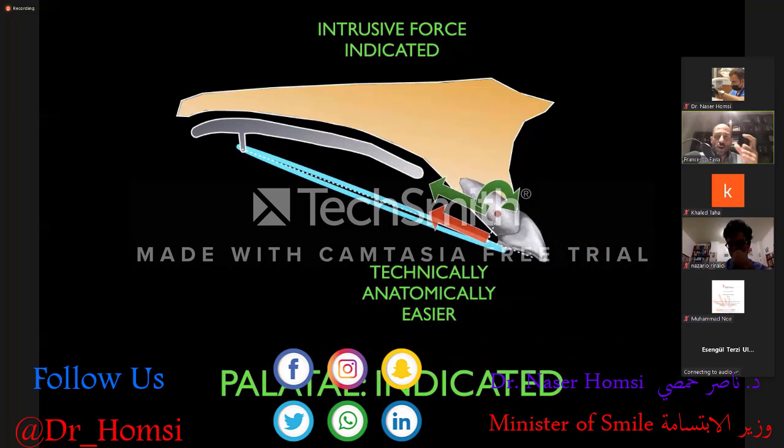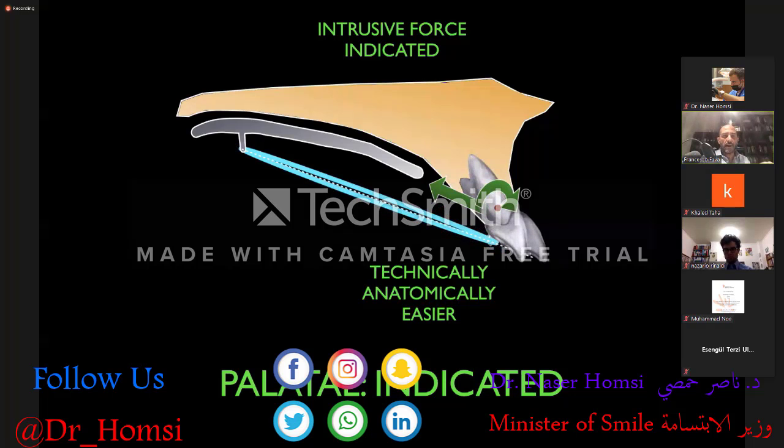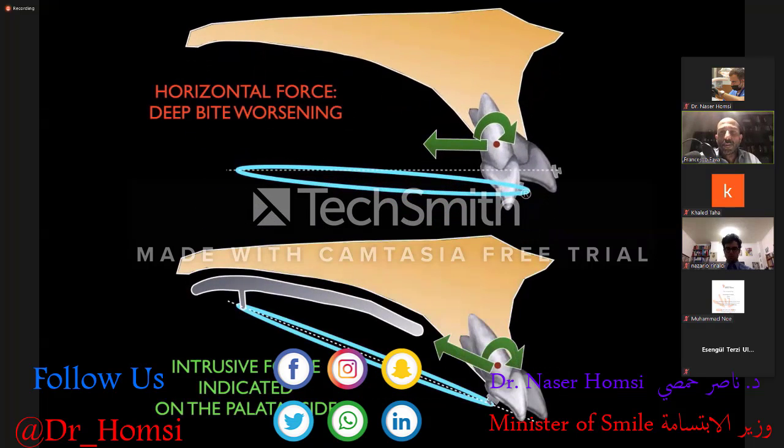We could try to change the point of application of the force, passing to the palatal side of the incisor, and that would be much more indicated from a biomechanical point of view, because it would tend to intrude and to retrocline the upper central incisor. It is quite easy to obtain anchorage in the palate, because we can use palatal bars with hooks in order to obtain a point of application of a retraction force. So we decided to go, in this case, to the palate in order to retract and retrocline the upper incisors.